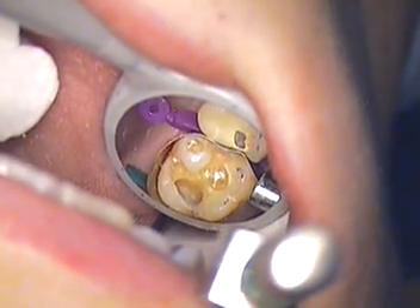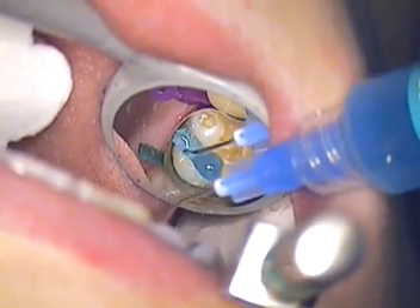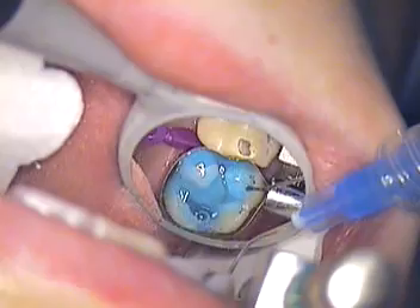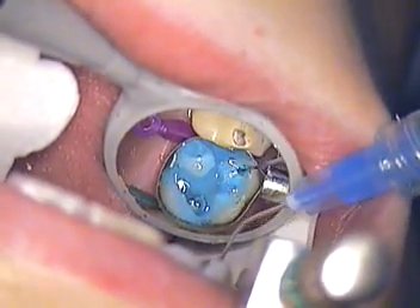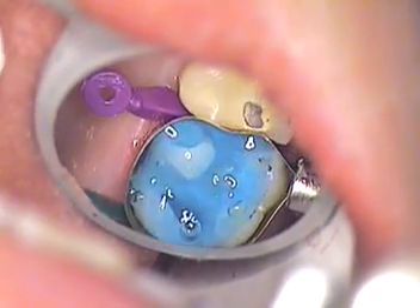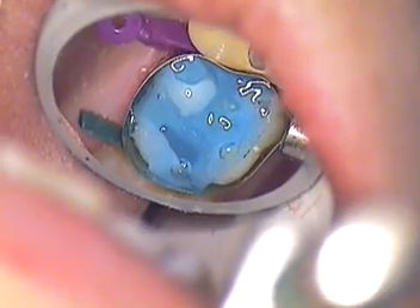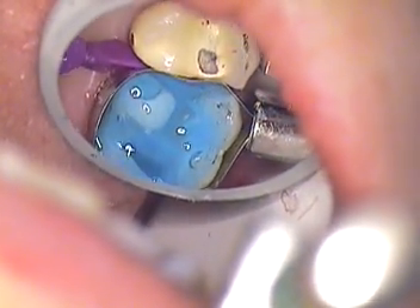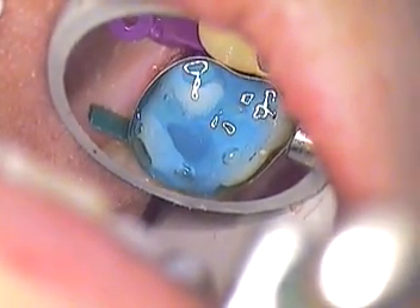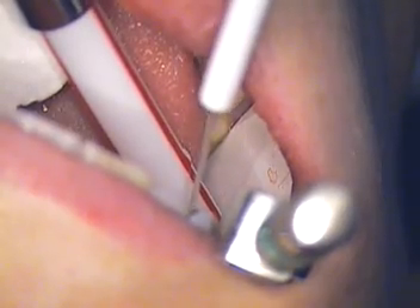We're going to go ahead and etch the tooth — a total etch — covering all the vital areas that we're going to bond to. We had to use a particular band; the top of our band is 0.0015 of an inch thick. Let's go ahead and rinse that now, just keep rinsing.